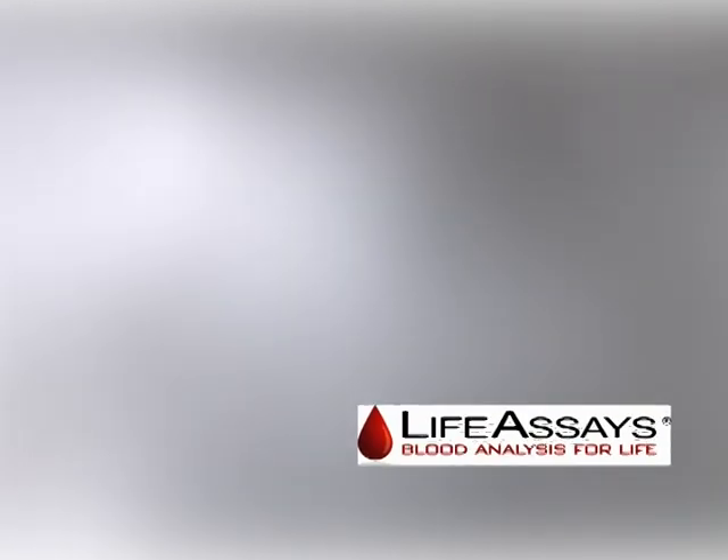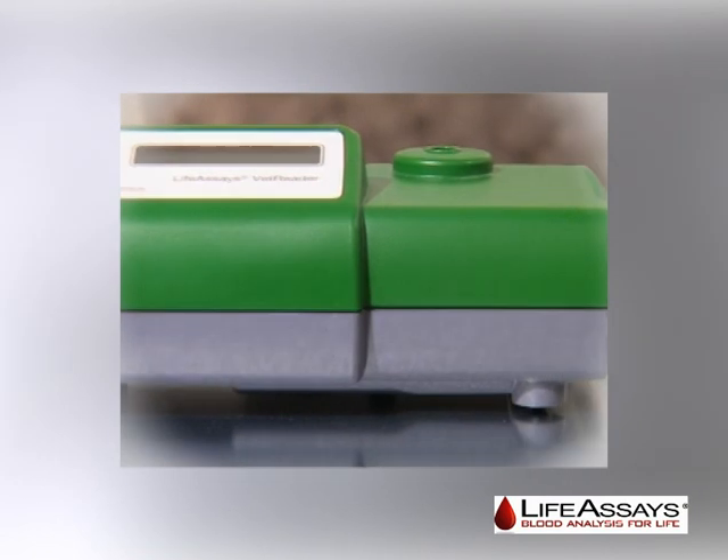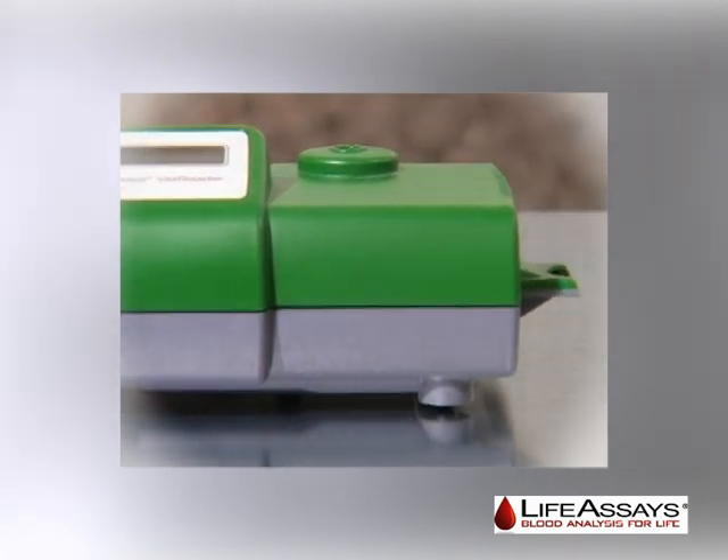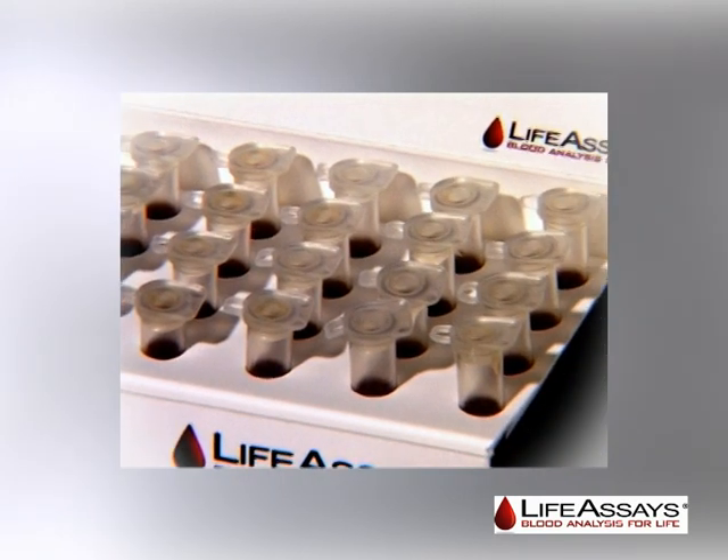The Life Assays VetReader is a Life Assays product for veterinary medicine. This demonstration video provides essential information for users regarding system handling and operation.